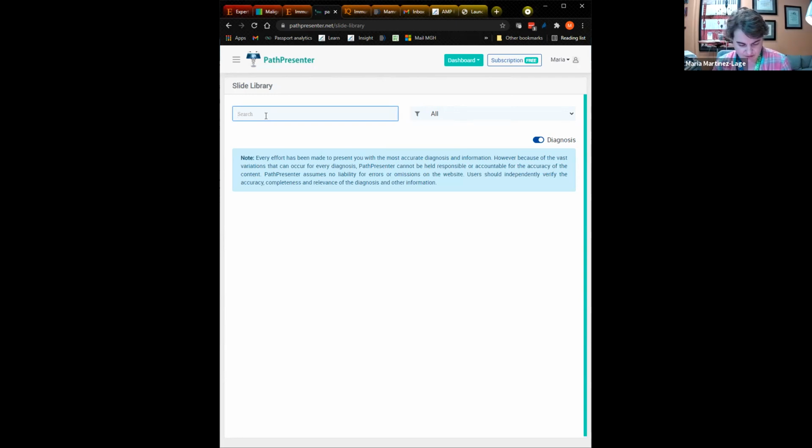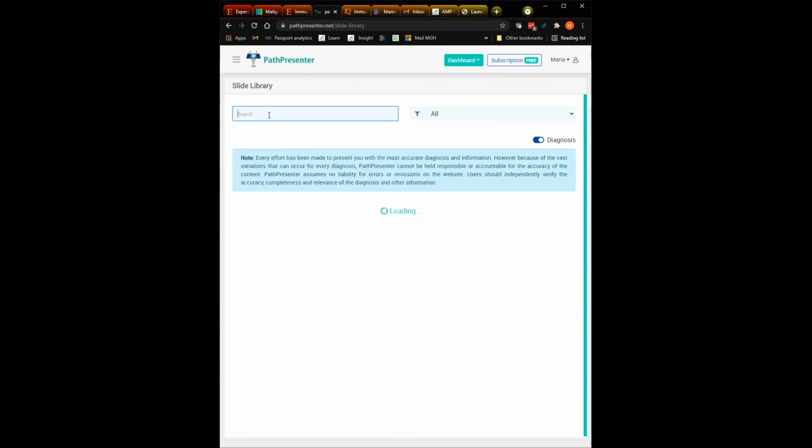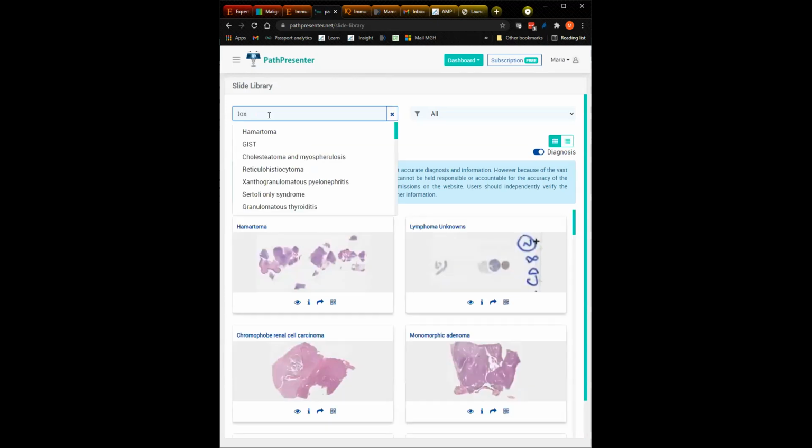All right. Let me open my list. Okay, so we did choroid plexus. We did pituitary adenoma as well. We did not do medulloblastoma. We can do the infections, Toxoplasma, Cryptococcus, cysticercosis, and others. And we can do those neuronal.